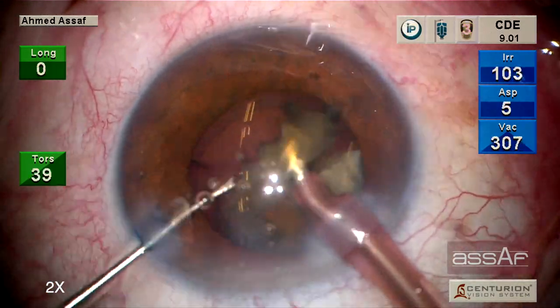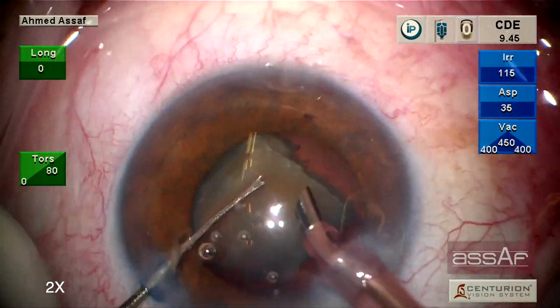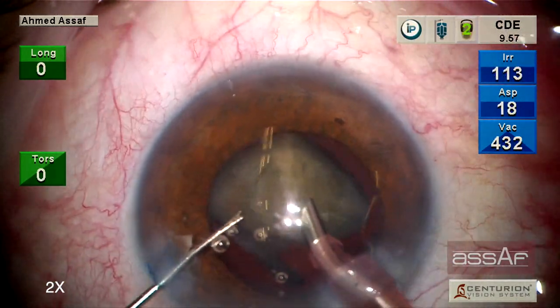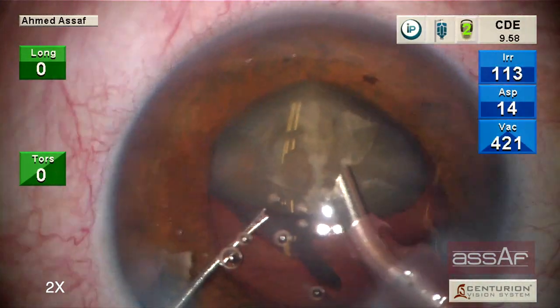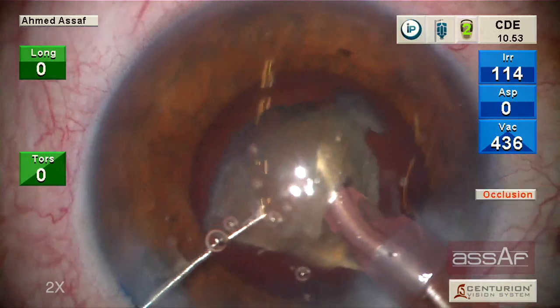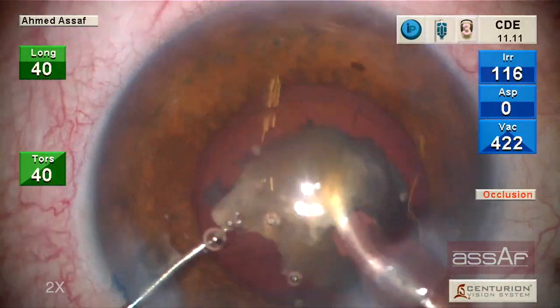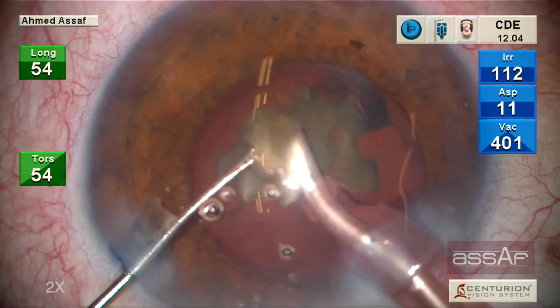This is the last quadrant, and you can see the sharp, beautiful cut of the MyLoop through such dense cataract. The ultrasound energy is tremendously reduced — the CDE is less than 13, which is my usual number for softer nuclear 3-plus cataract.